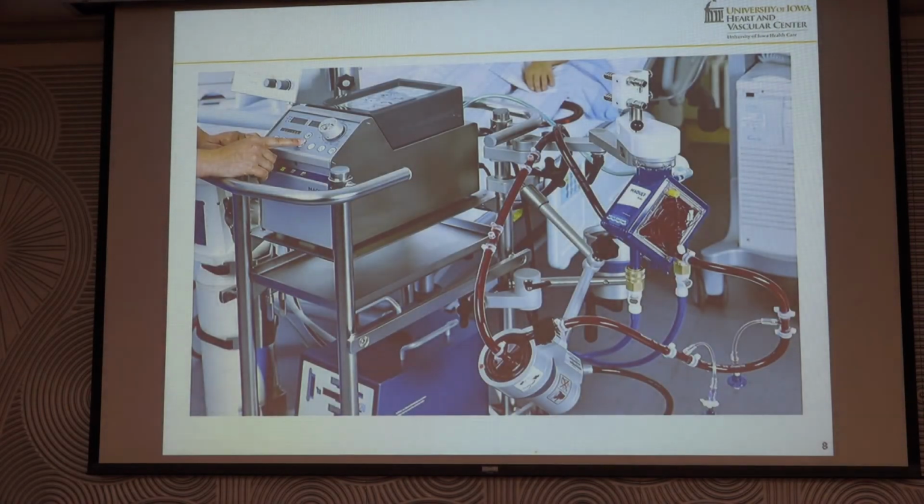Many of you recognize this is our rotoflow unit. We utilize this on all of our neonates and small pediatric patients. What's not really indicated here, the blood usually coming from the patient is usually dark. Deoxygenated blood running through the pump goes into the oxygenator, and what comes out the backside is bright red, oxygenated blood.